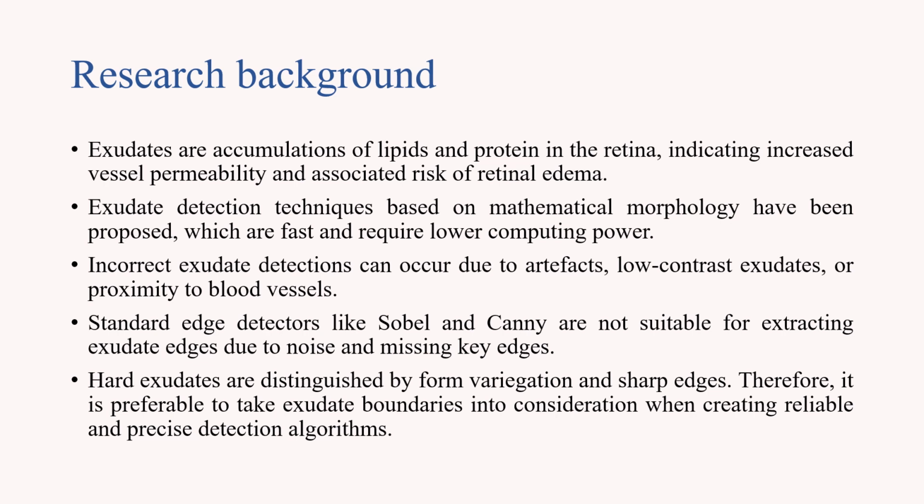For the research background, the exudates are accumulations of lipid and protein in the retina, indicating increased vessel permeability and associated risk of retinal edema. The exudate detection technique based on mathematical morphology have been proposed, which are fast and require lower computing. Incorrect exudate detection can occur due to artifact, low contrast exudate, or proximity to blood vessels.